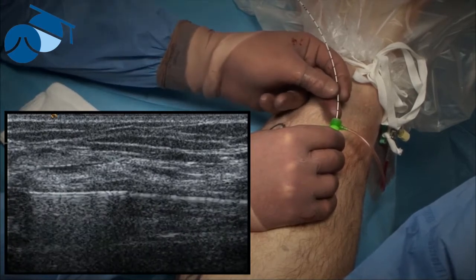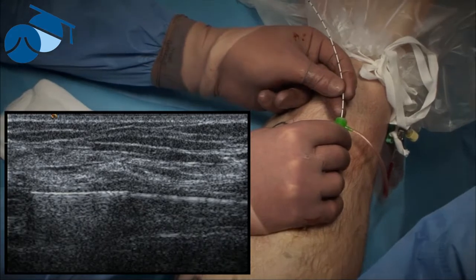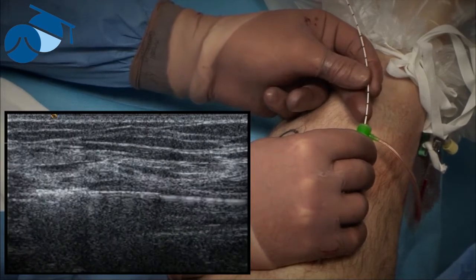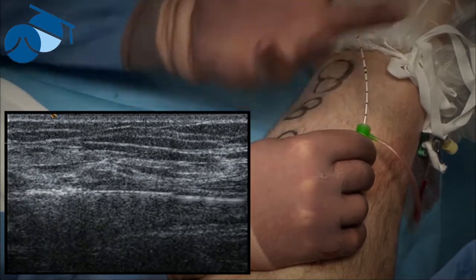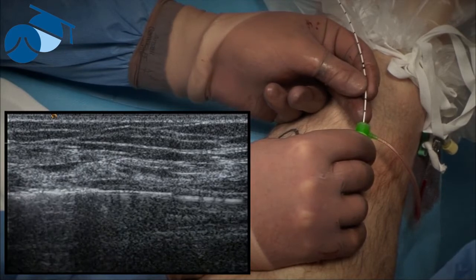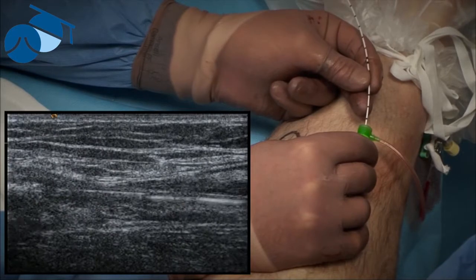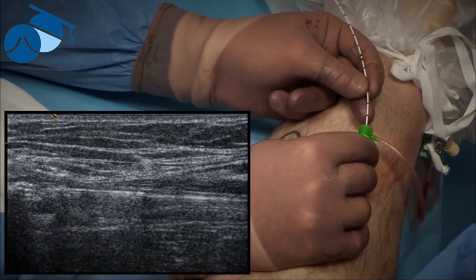We're about to start treatment now, and if you watch on the ultrasound you'll see the effects of the laser immediately. Okay, patient, if you'd like to just tell us if there's any pain at all when we start. Now I always stop just after the first one, give a little tug, because you do sometimes get with the radial firing a little bit of the vein getting caught on the end. I just like to pull it off, and we're just going to do that again for the next centimetre. And again I can feel it caught there, so just a little tug and finish off that 2 seconds.